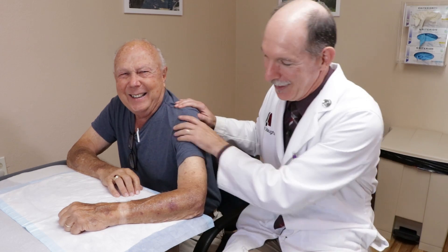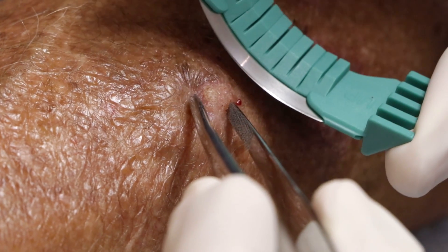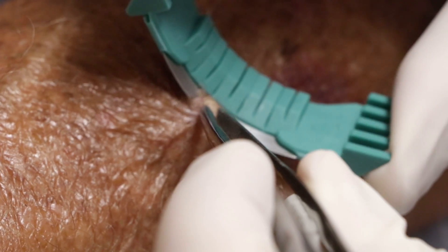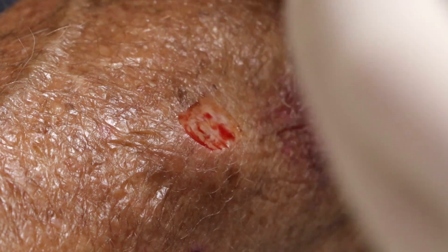I'll hold you here while we get it prepped and we'll numb it up. It is prepped. Alright, we'll go ahead and get this off of you.